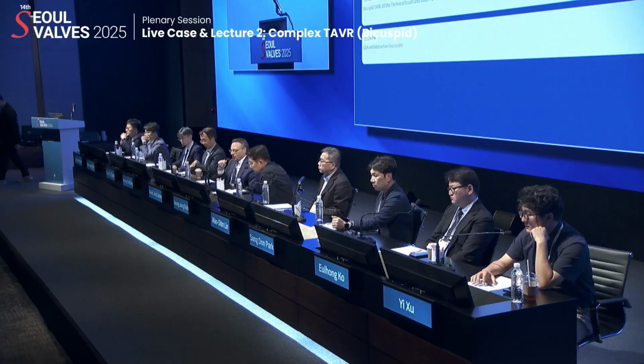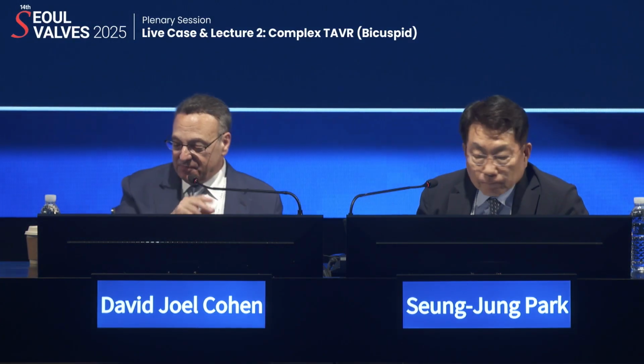Thank you very much, Kentaro. It's a very nice presentation, and I think we'll have some questions after. And now, back from the cath lab, I finally let him out. Jung-Min, welcome. And you're going to tell us about the Asan approach to bicuspids?